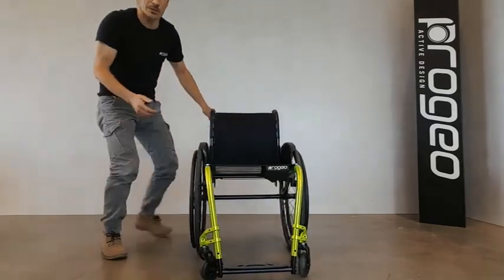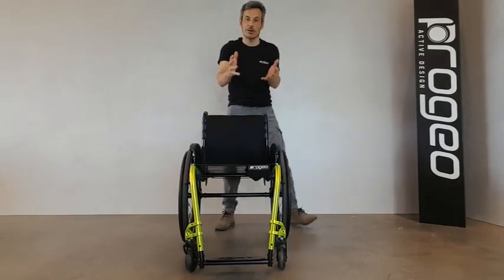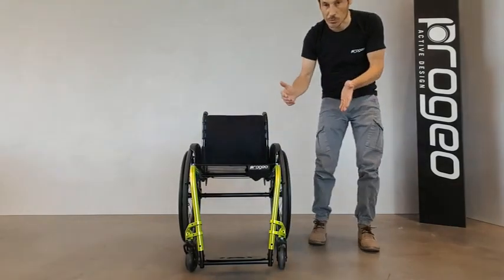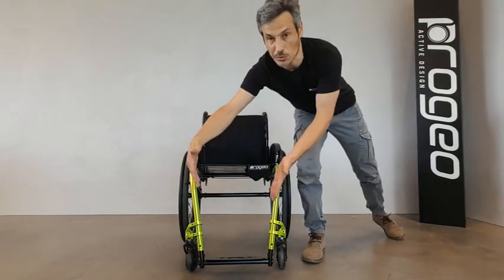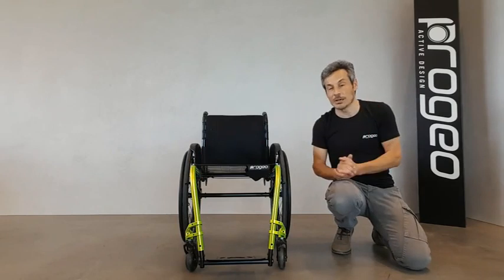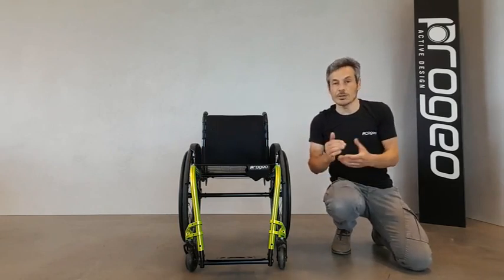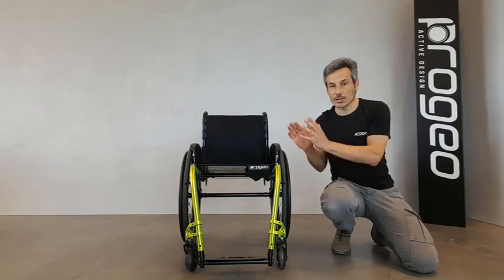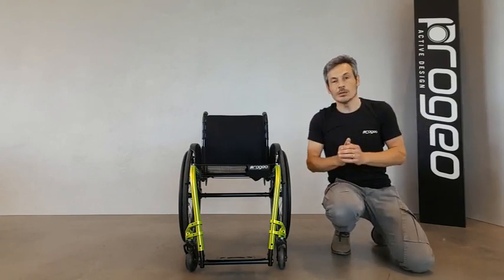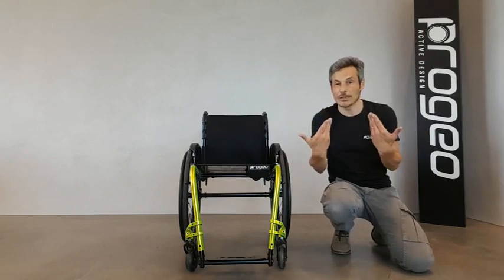The peculiarity of this wheelchair is when you have a look at it from the front — you should notice the convergence of the two front frames, or, if you wish, you can call it a V-shaped frame. However, in the order form there is also the possibility to order the same chair with a parallel frame in order to have flip-up foot plates or even split foot plates.